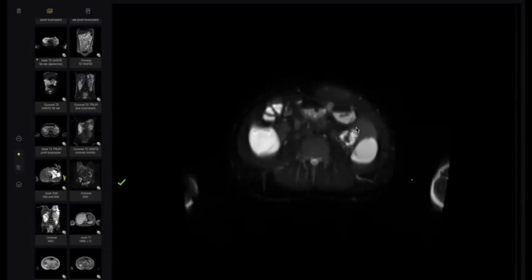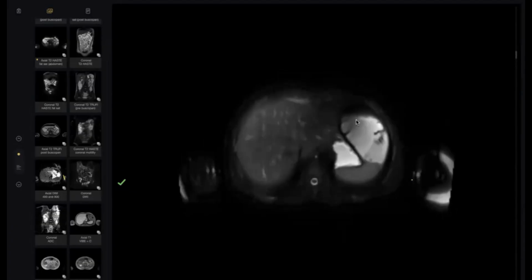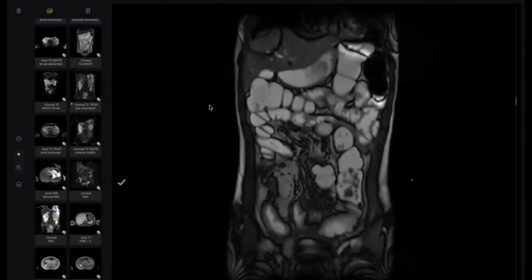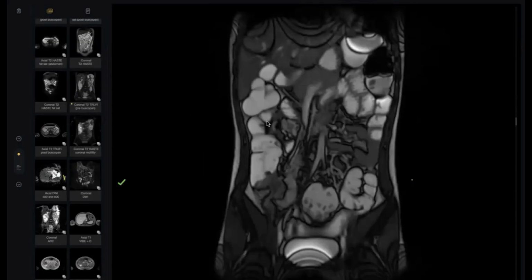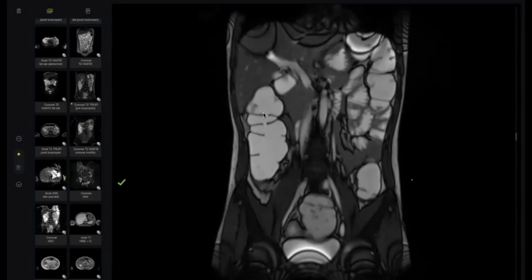Number three, think about masses or cancers or diverticulitis. Okay, my colleagues, MR enterography: the patient takes a lot of fluid, whatever the amount, I think from 1.5 to 2 liters, and some osmotic material with it to shift the fluid into the bowel to distend it. Some preparation, maybe some Buscopan also to avoid spasms.